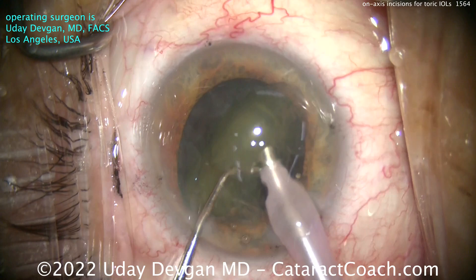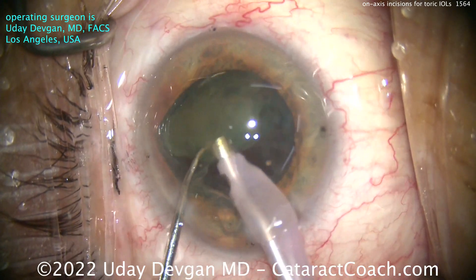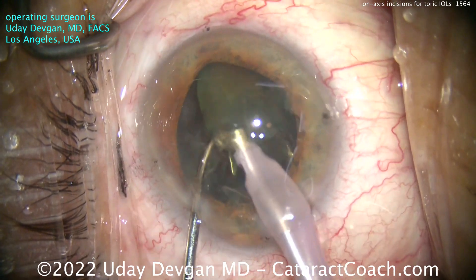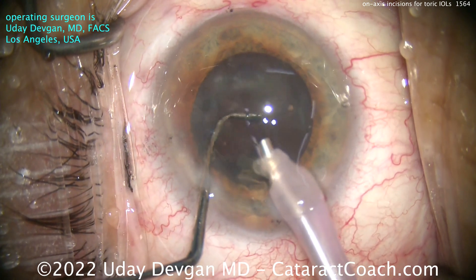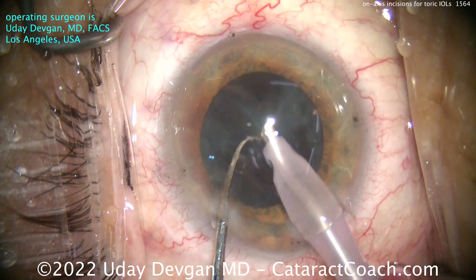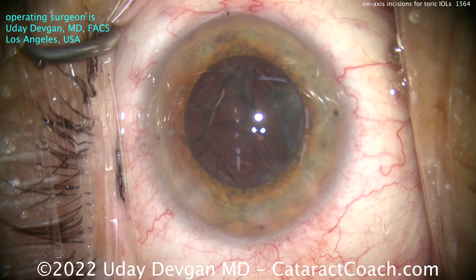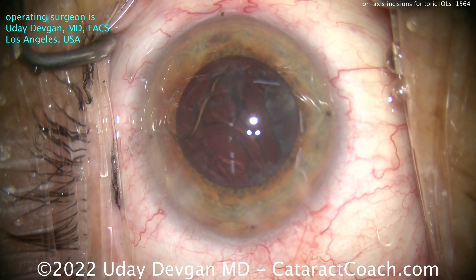Same with a cross tailwind. These crosswinds are much more challenging to predict. And remember this — you may think you can predict your surgically induced astigmatism for every case, but you can't. Every eye is not the same. Some eyes have a small cornea diameter of 10.5 millimeters, some have 12.5 millimeters. Some have a thicker cornea, some a thinner cornea. There are corneal elasticity differences. An older cornea behaves differently than a younger cornea. You cannot exactly predict your SIA — surgically induced astigmatism.